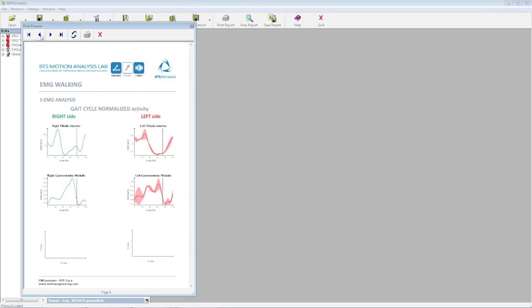So as we look here, we can see the same activity. So at the very first beginning, at the end of the gait cycle, and the same thing for the gastrocnemius medialis, in which I have the muscle active until I do not have the disconnection of the foot from the ground. Of course, this report can be printed, can be saved as a PDF.